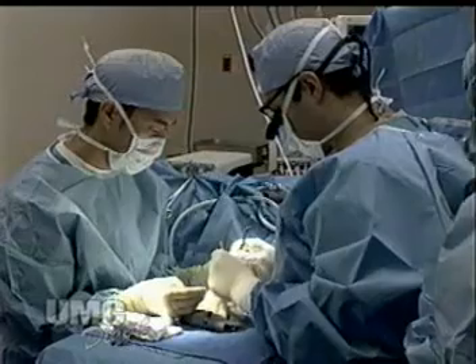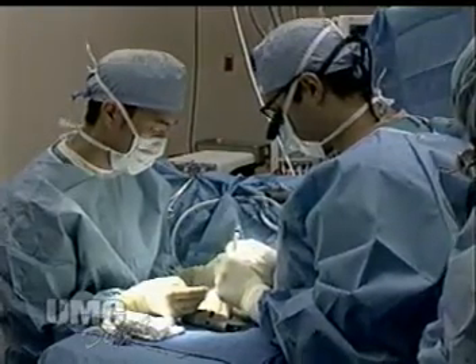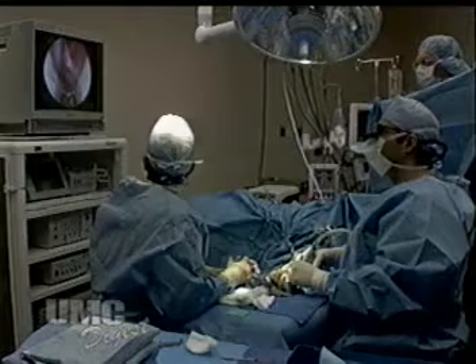With this procedure, we actually put a small incision into one of the wrist creases that will heal very well and we conceal it within our regular skin creases. Then we put a camera inside the wrist and we cut just the carpal tunnel ligament — the transverse carpal ligament — and that can be done from inside without cutting all the other tissue that does not actually contribute anything to the disease.